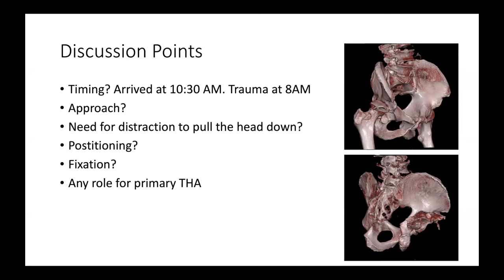I think when I'm starting to look at the CT scans, anything with the fracture line getting more cranial, more anterior, like over that 12 o'clock position, if it's more than 2 centimeters plus over the head, that's just the apex of the fracture. And then I'm worried about getting some sort of fixation, plate fixation, to be on top of that. And so it makes me want to think about something else as well.